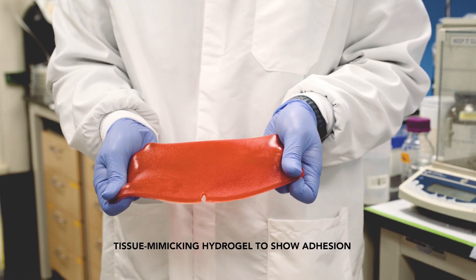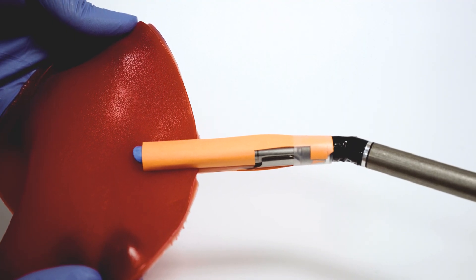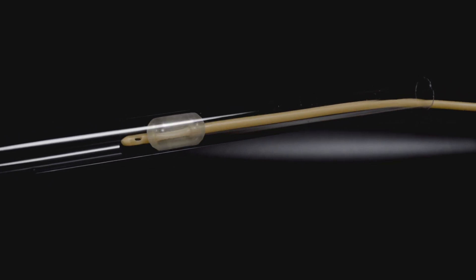Through a series of demonstrations, we show how the patch can be combined with a laparoscopic stapler to form a linear seal, or a balloon catheter to seal hollow organs and vessels.